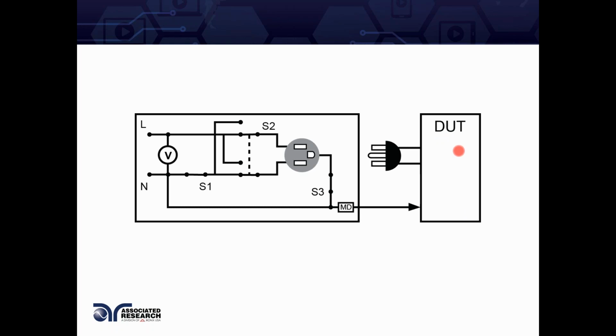So your device might look like it's off. An operator or a patient might think a device that's off doesn't pose an electrical shock hazard, but in reality, there may be voltage coming into the product. It's just that it does not have a complete path flowing back to neutral. It looks like the device would be off, but there's still additional hazard associated with having line coming into the product. So we're simulating a condition where, what if the neutral wire opens up? Does your device cause additional leakage through this measuring device?